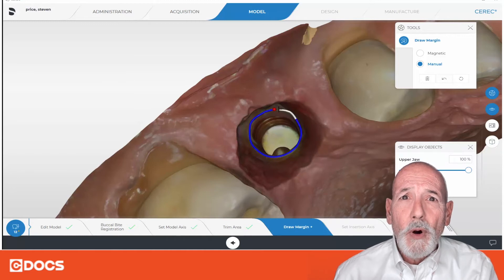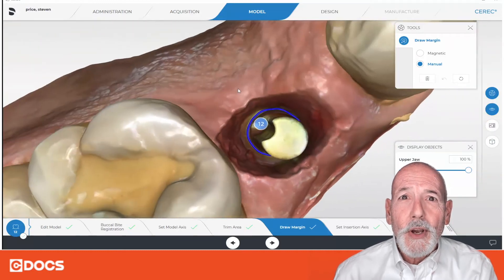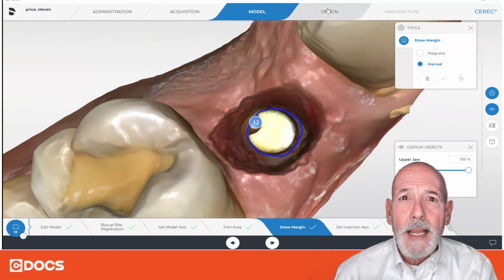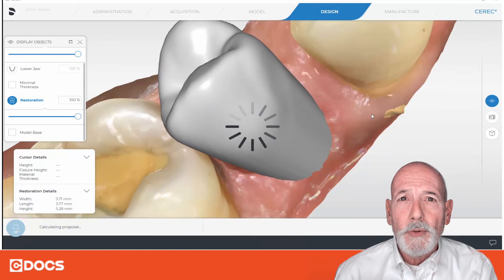Like I said before, all proposals start at the margin and go up from there in this case. So we went ahead and drew the margin, and now we move on and go ahead to design and get our proposal here.